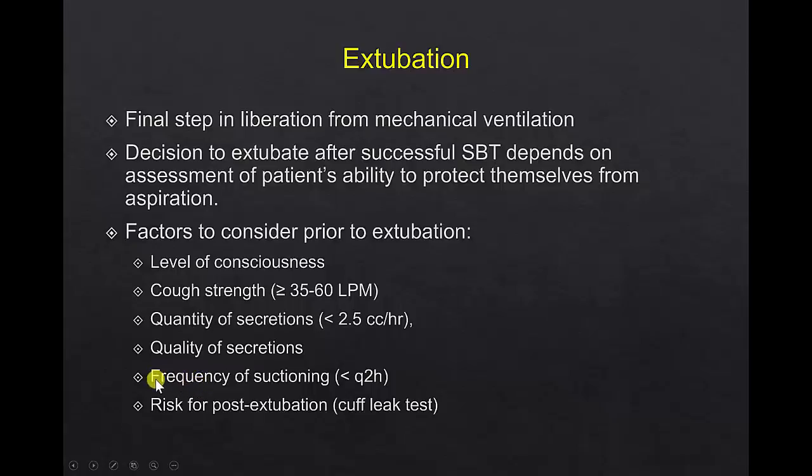Another fallacy, or another confounding factor, is that the tube itself does contribute to the frequency of secretions. So removing the tube can actually paradoxically improve the amount of secretions. So the tube itself perpetuates need for suctioning to some degree.